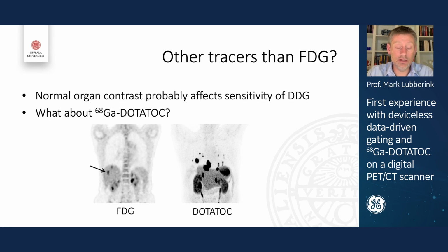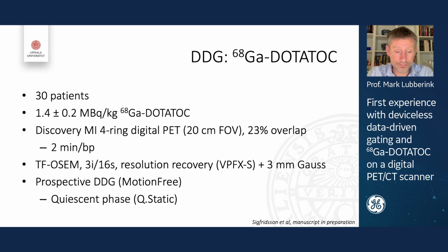So we included so far about 30 patients in a study with gallium-68 DOTATOC. They each underwent a whole body scan on a Discovery MI 4-ring digital PET-CT scanner with a 20 centimeter field of view, and we use a 23% overlap between bed positions. And we scanned 2 minutes per bed position. Images were reconstructed using time-of-flight OSEM with 3 iterations, 16 subsets, and resolution recovery, plus a 3 mm Gaussian post filter.